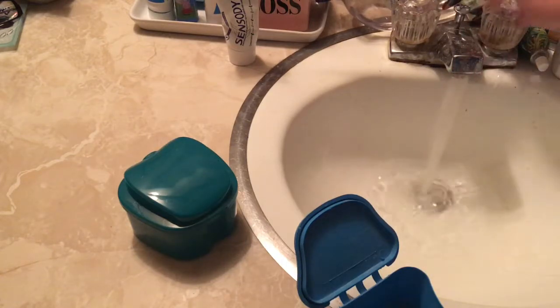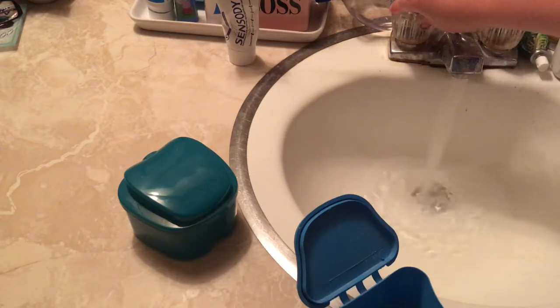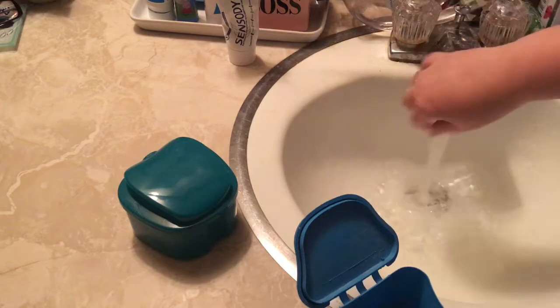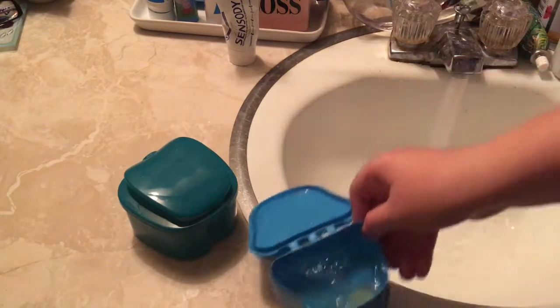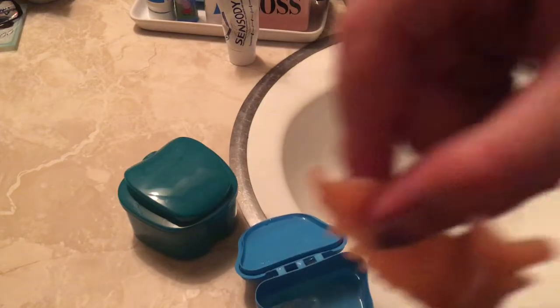That other denture case in the back I actually got from Dollar Tree. If you're in need of one, you might check there and see if they still have them — it was about a year ago when I got that one, but it would be worth a shot. They also have denture tablets.